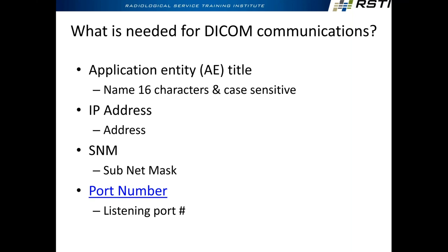And who generally keeps all of this information? Usually IT or the PACS department, it depends on the facility. If IT and PACS are integrated, it might be its own thing, or PACS might be its own thing, but somebody in IT or PACS should have all of this information. You guys are probably all running into small facilities, smaller customers where there's no one in this role. Now you have to figure out what's the IP of this, what's the AE title, what port numbers, digging around settings, finding stuff. But hopefully the customers are keeping track of this in at minimum a spreadsheet or something along those lines.